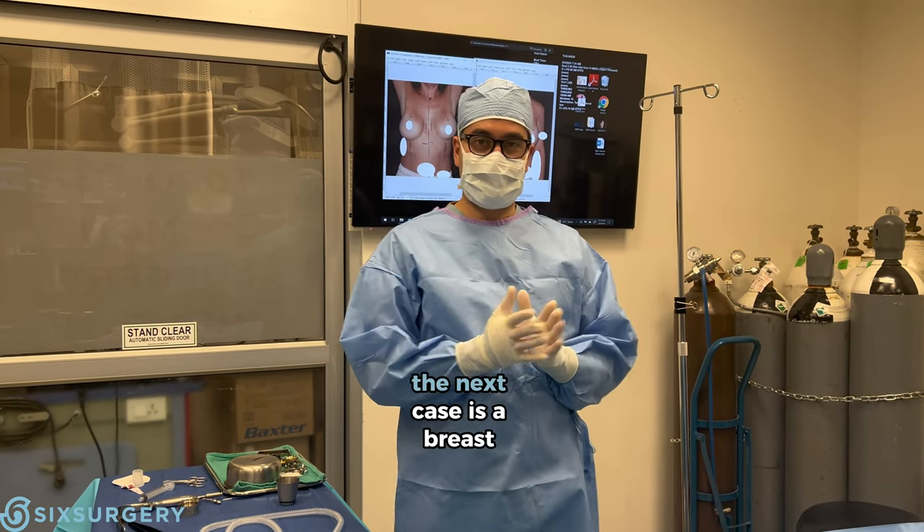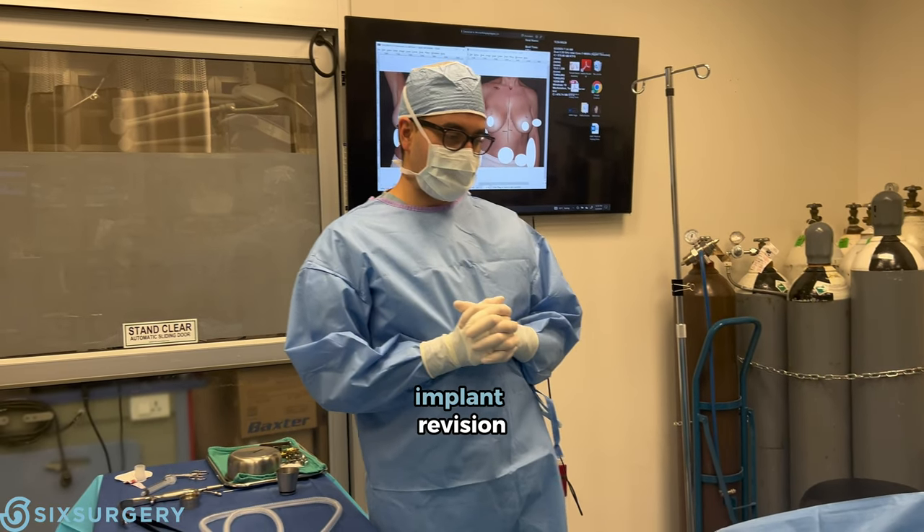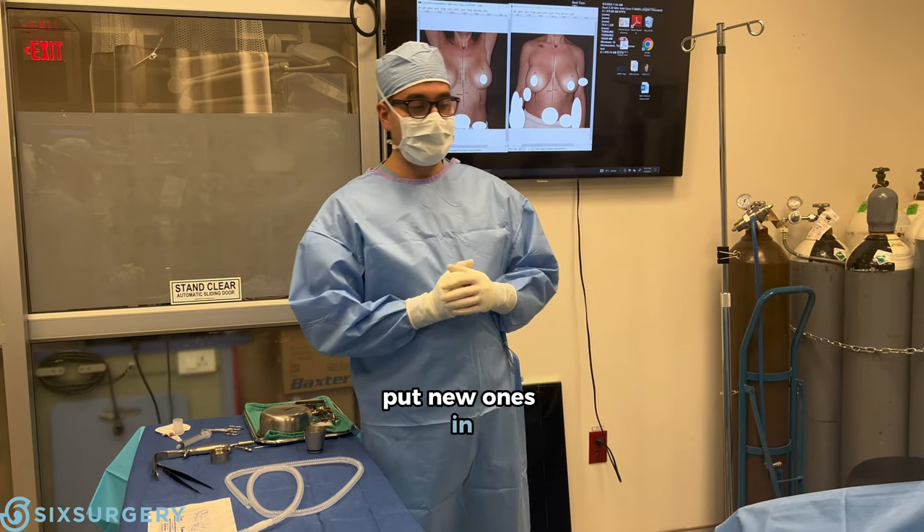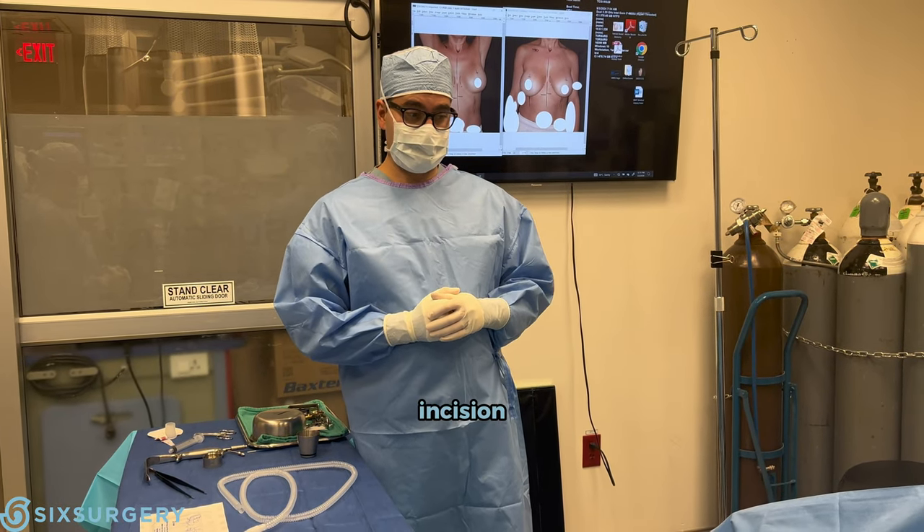Hi everyone, welcome back to the OR. The next case is a breast implant revision. The plan is to take the implants out, put new ones in, and to do a lift with an anchor incision. So let's get started.